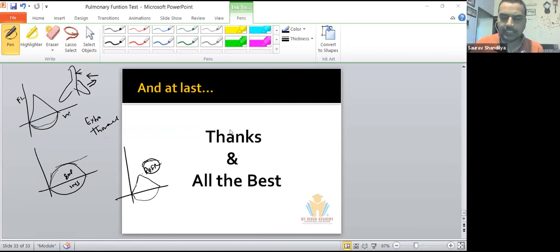It may be possible. So as I told you, you asked about upper airway obstruction. I told you intrathoracic and extrathoracic. Extrathoracic, it could be like this. Okay. And intrathoracic, it could be like this. There is no PEFR normally possible in intrathoracic airways, because how will the PEFR be there? Okay. That is the one thing.